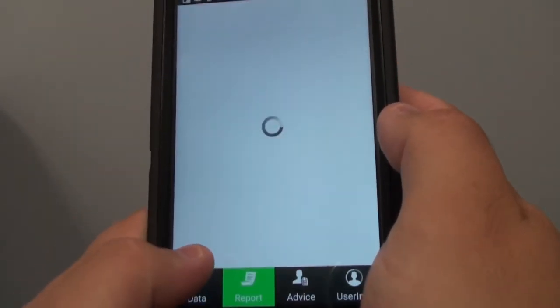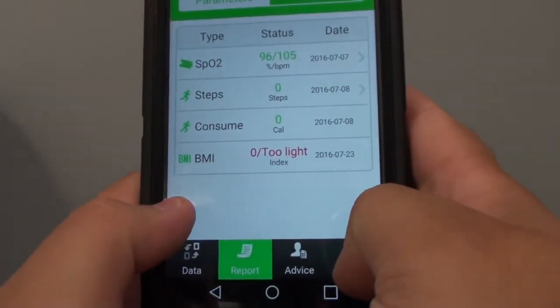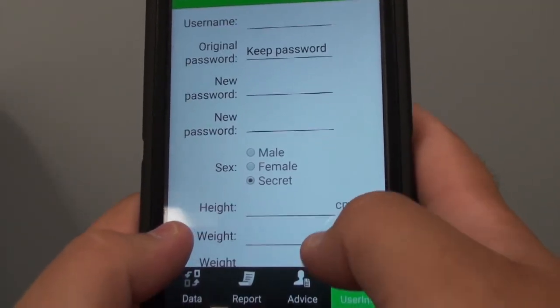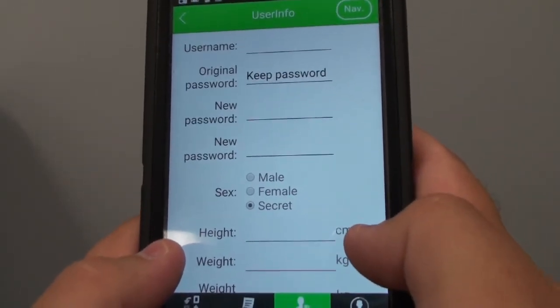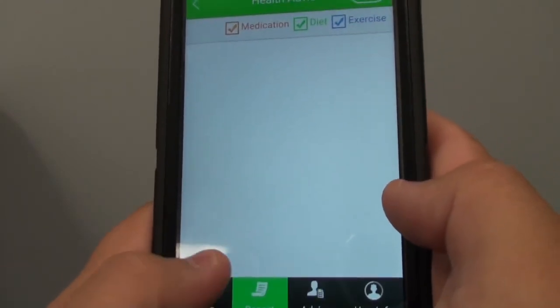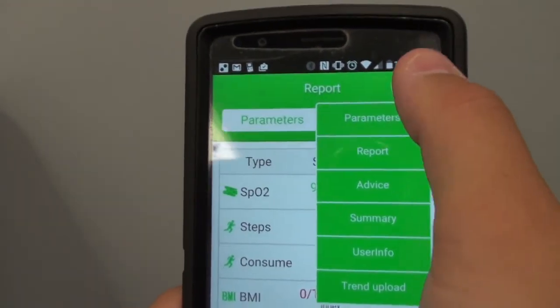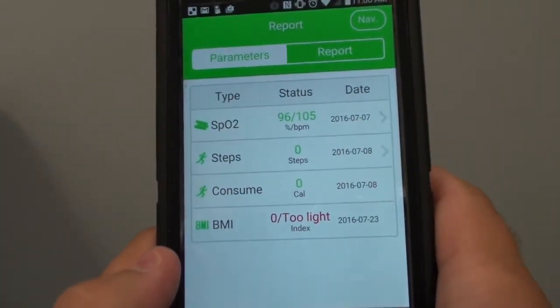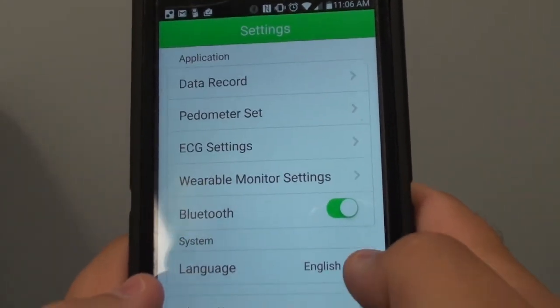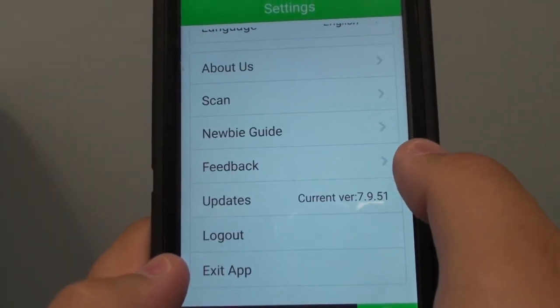The app has reports, user info, and advice sections. Underneath the reports you'll also be able to navigate all the different options. Back on the data page you can go to 'More' where you can set different parameters, enter feedback, and check out the updates.